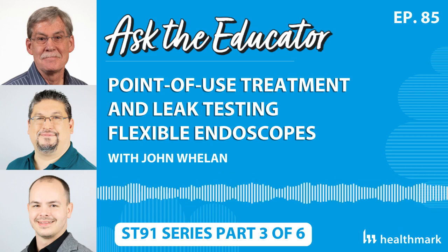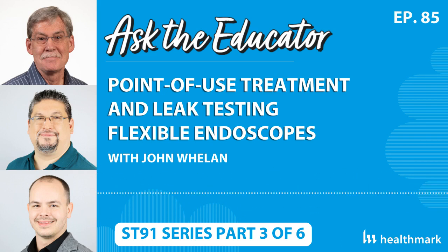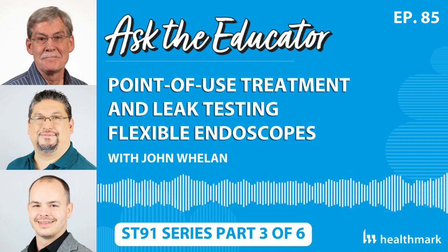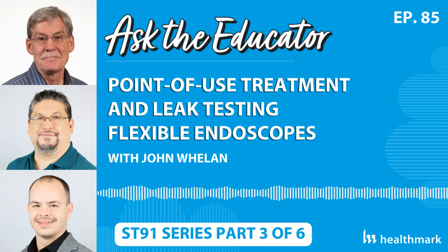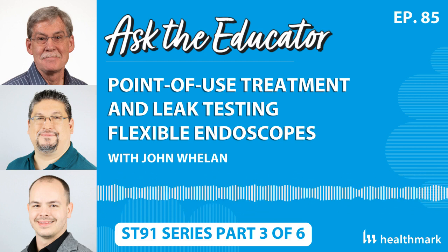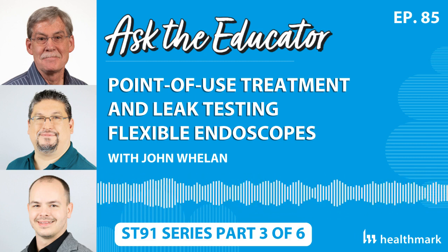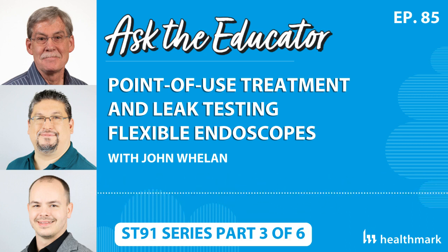It's actually one of those things that we used to have. I don't know if this ever happened to you, John or Adam, but we had an endoscope repair company. It was a third party, not the OEM. And they suggested the same thing, only this was years and years ago, before I was aware of any sort of commercial device or option to test for this PSI. So our clinical engineering department kind of rigged their own PSI measuring device into the existing Olympus MU1, which, of course, we're not recommending.